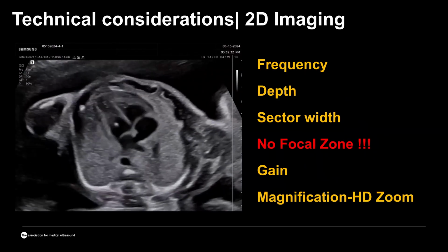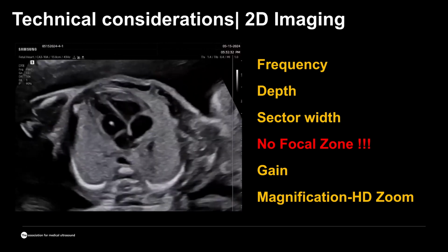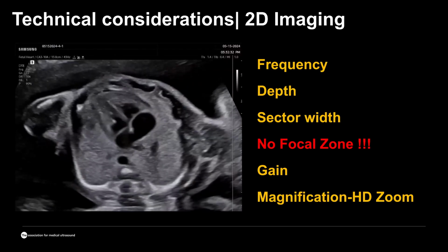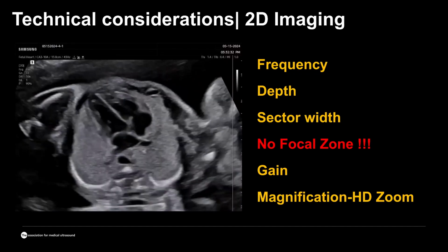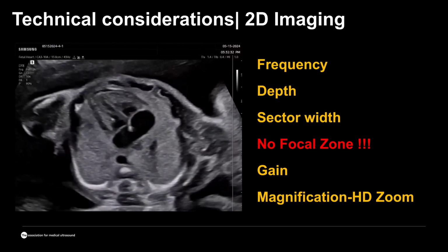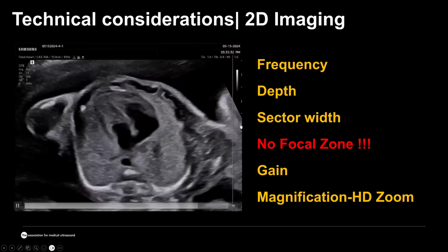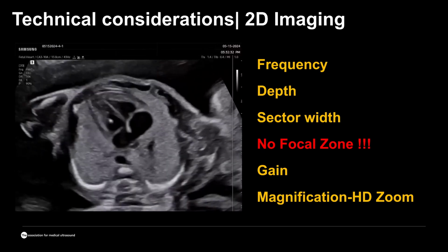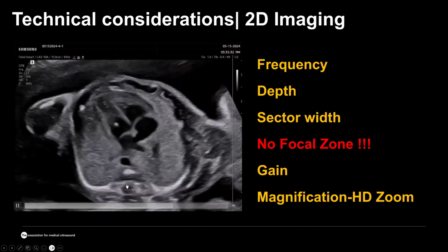First, I would like to share with you that recent advances in the physics of ultrasound help us get rid of one of the controls. Most of the modern systems, including the ultrasound from Samsung, have electronic beam forming and focusing, so they don't really require any focal zone. In other words, we would usually place the focal zone in the area where we want the beam to be the most focused. This is the area of interest. But as you can see on this image, the image actually has the best resolution from top to bottom.